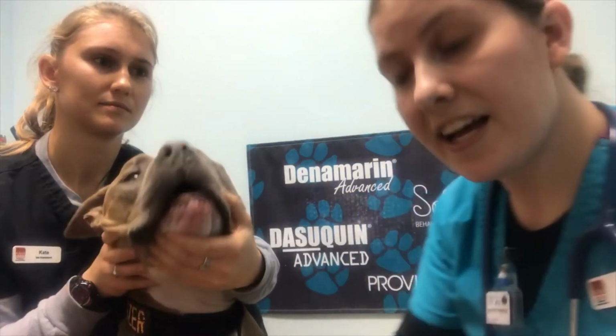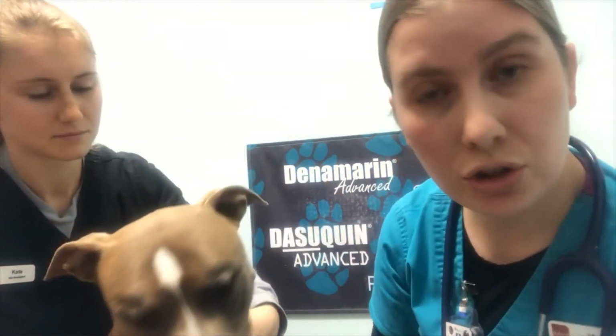Alright, so neither of his eyes picked up any stain, which is good because that indicates that there are no abrasions to the cornea, no ulceration or potential scratches to the corneal surface. If there had been any stain pickup, we would have seen a bright neon green splotch in that damaged area, and that would have indicated that we would have to follow up with treatments. But as there's no stain pickup, then he's good to go.